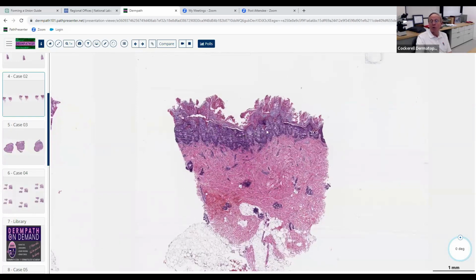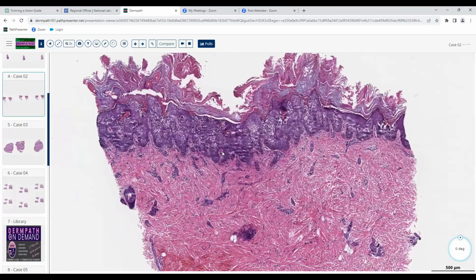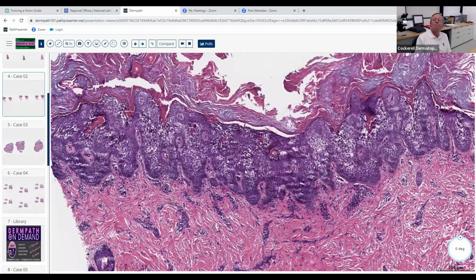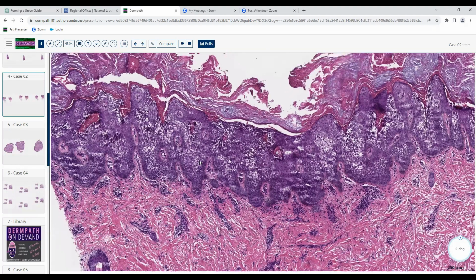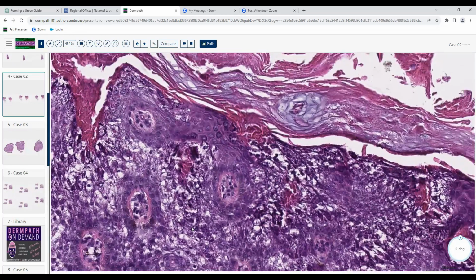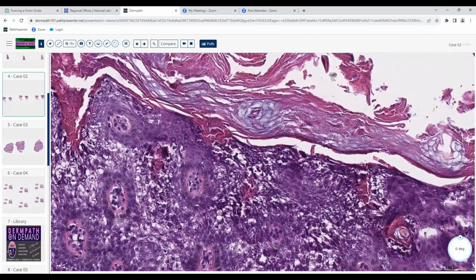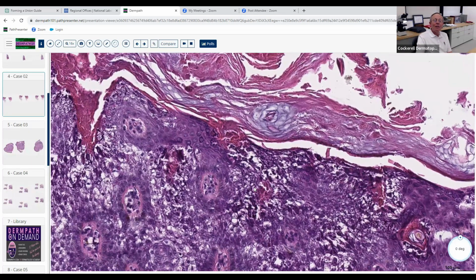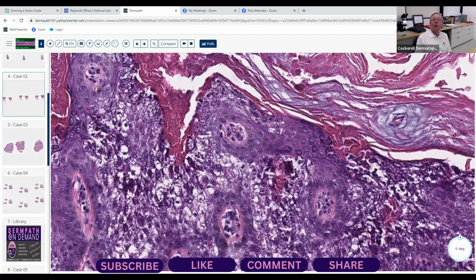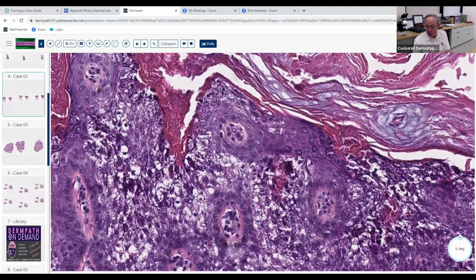Okay, so the main changes are going on up here, as you rightly pointed out at low magnification. Let's go to higher magnification. And now what do you see? Well, sort of more of what I saw before. Within the epidermis, there's acantholysis. That's what it looks like to me. Or I don't know. What's acantholysis? Cells splitting apart from each other, like the desmosomes being lost. Good. Exactly. Very, very good. That's exactly what's going on here. So that's exactly what acantholysis is.